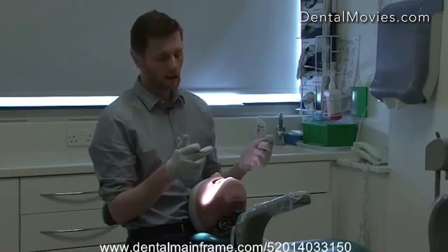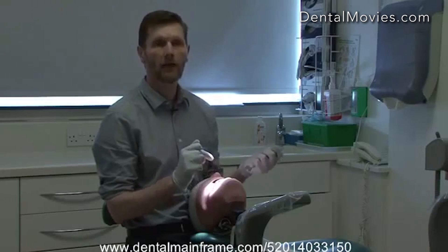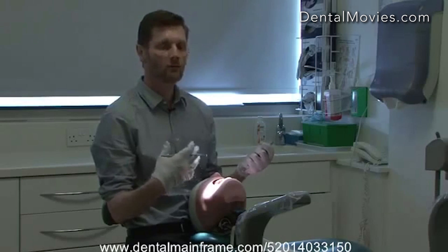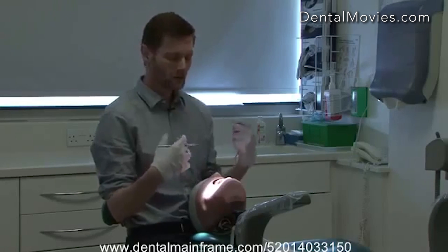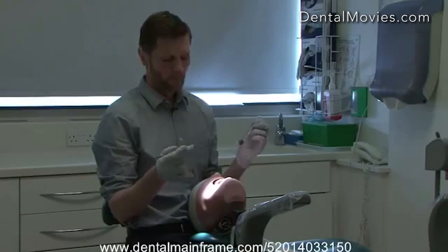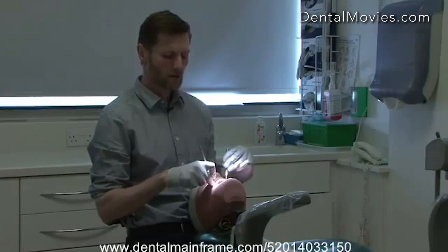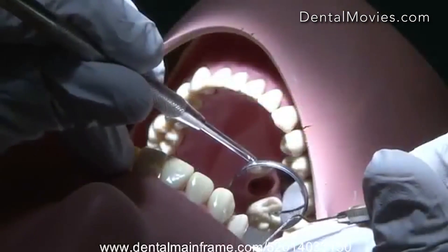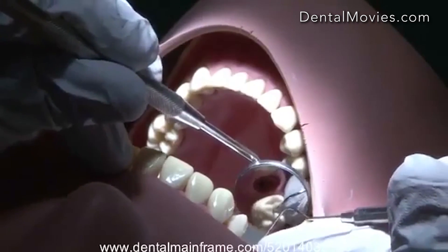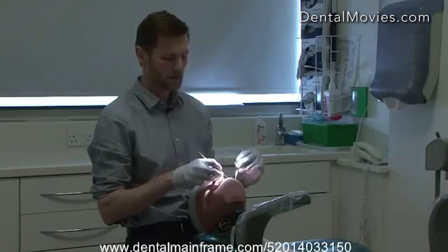However, when we're working on the occlusal surfaces of the posterior teeth — particularly the upper teeth — we have to work with a mirror. The tendency at first is to avoid this and get into bad habits which will have a bad effect on our posture. If we're looking at the occlusal surfaces of the upper teeth, we can get the mirror and the light adjusted so that the light reflects onto the tooth and we can see it clearly. By doing this we can sit back, maintain our posture, and be comfortable in the dentist chair.